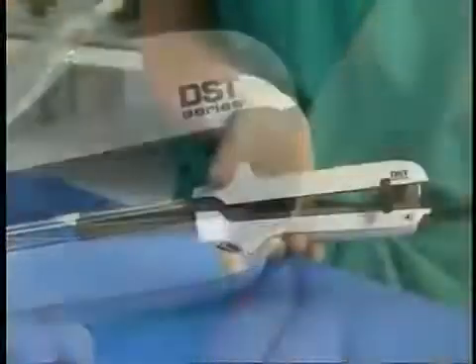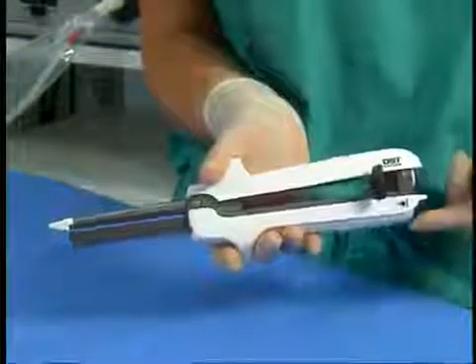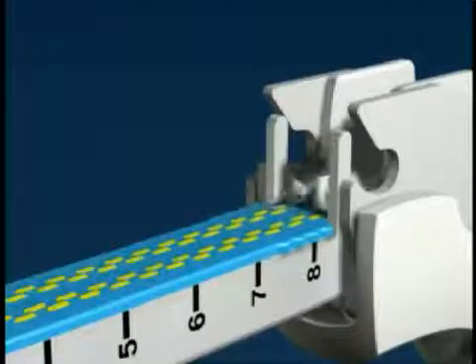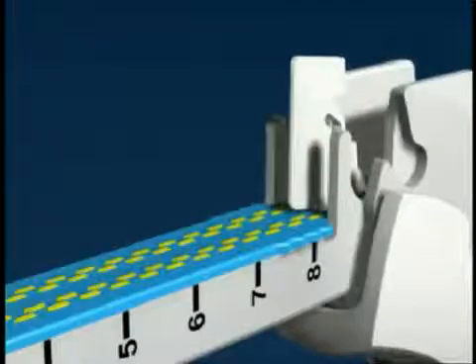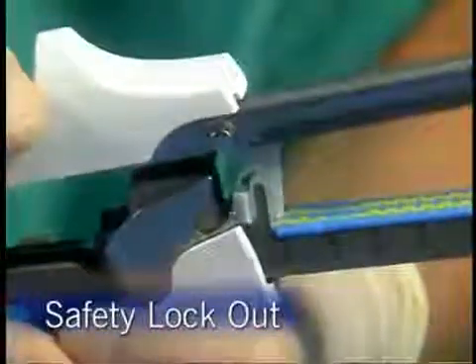To separate the instrument forks, simply press the black release button with your thumb. A controlled spring mechanism will gradually disengage the halves. A plastic tab immediately covers the knife blade for safe handling of the SULU while unloading and reloading.